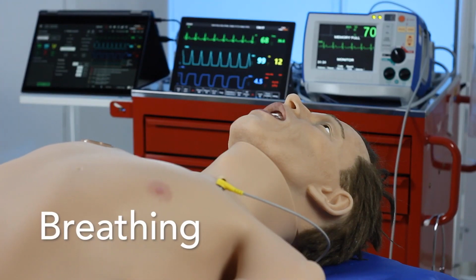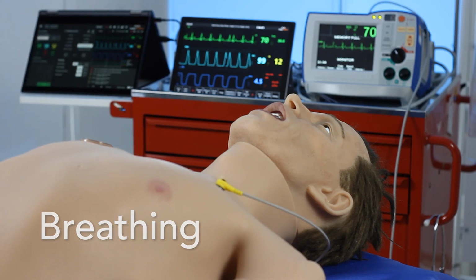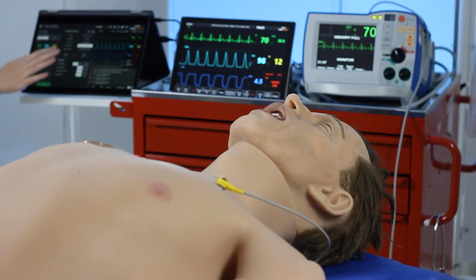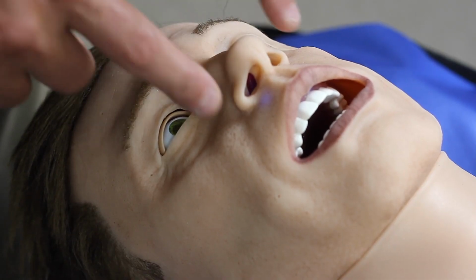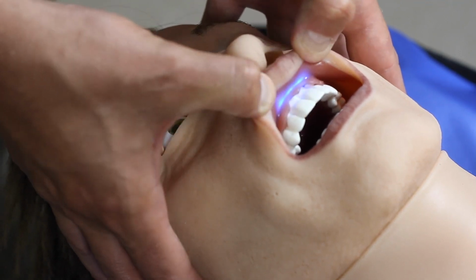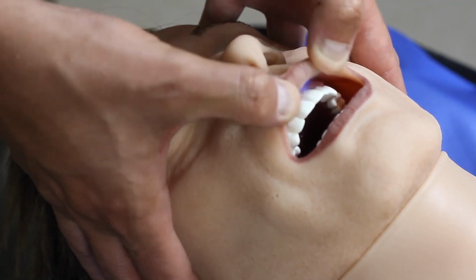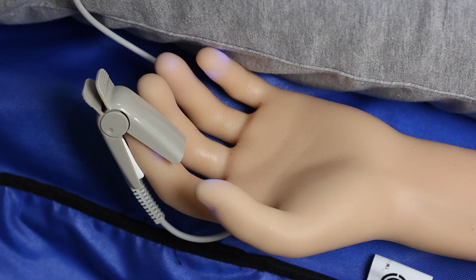His breathing can be controlled in a spontaneous fashion, giving you a wide range of respiratory rates. We can increase resistance and decrease compliance of the chest, therefore making it more difficult to ventilate him. We can also add in cyanosis. You can see the cyanosis under his nose, but you can also see it under his lips when I pull his lips back there. And he also has cyanosis in his fingers. This will enhance the learner experience and also gives indications of deterioration.